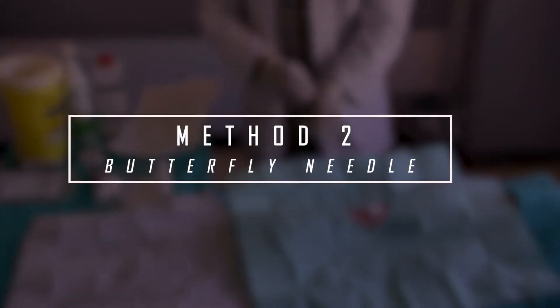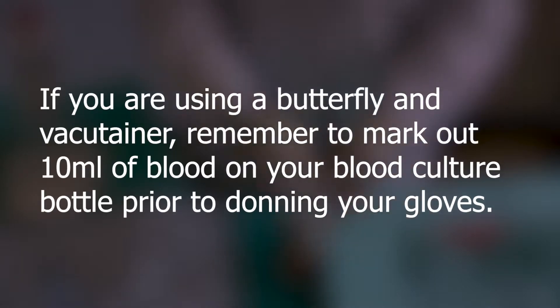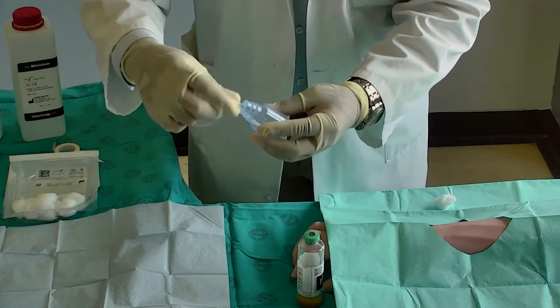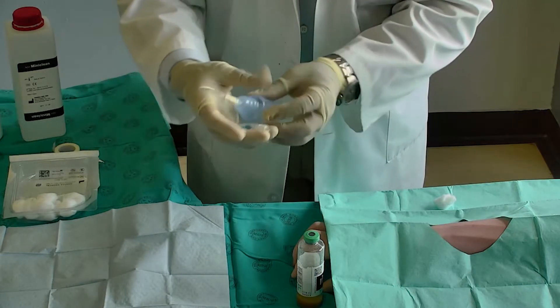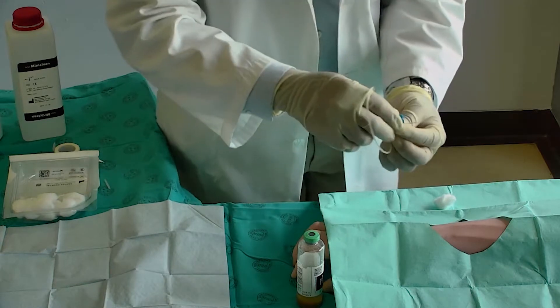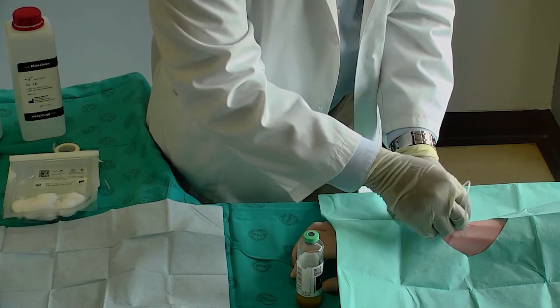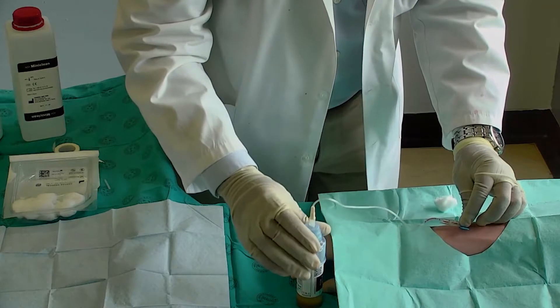Method two. Alternatively, you may use a vacutainer and safety butterfly needle. Mark 10ml of blood needed on the culture bottle. Connect the vacutainer and the butterfly needle. Anchor the vein by holding the patient's arm below, not above the venipuncture site. Gently insert the butterfly needle. Insert the blood culture bottle into the vacutainer to fill up to your 10ml mark.